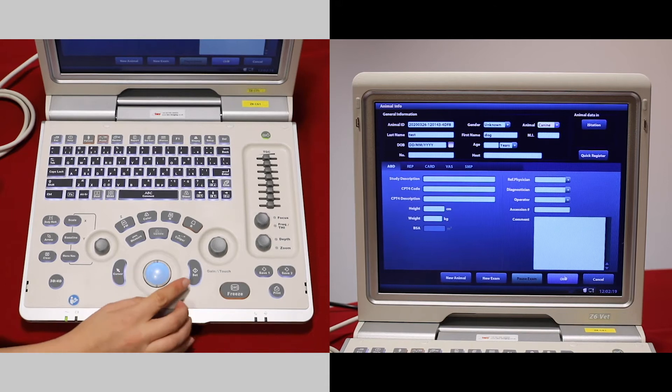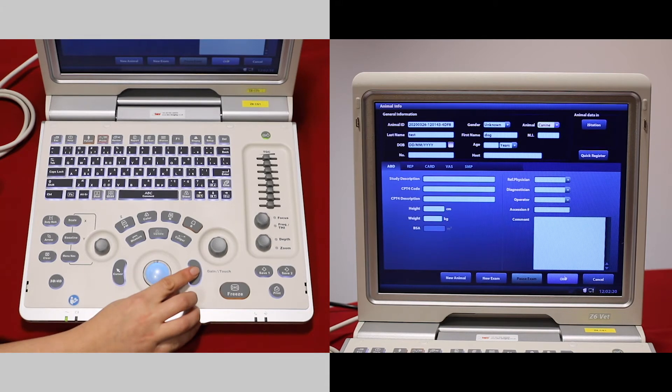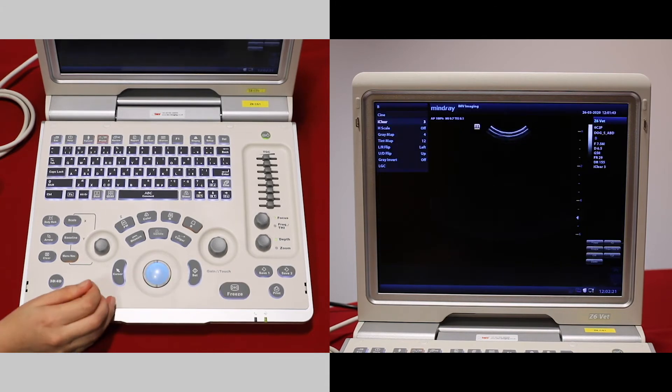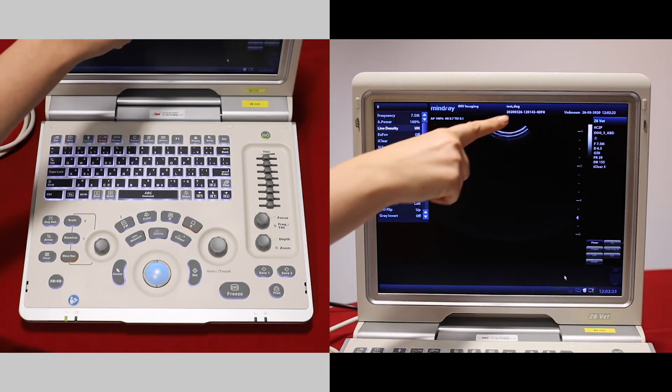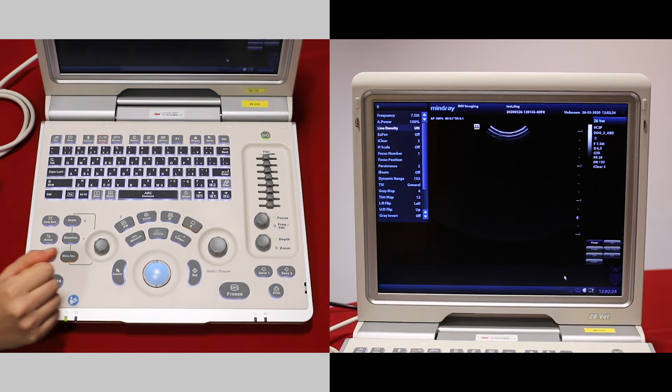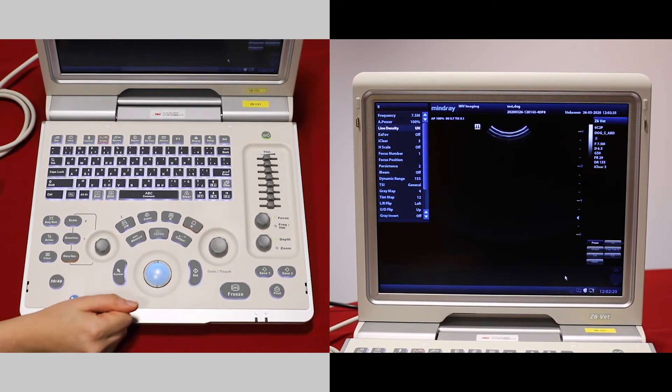Down to the bottom of the screen and using the set button, press OK, and then your patient details appear at the top of the screen.